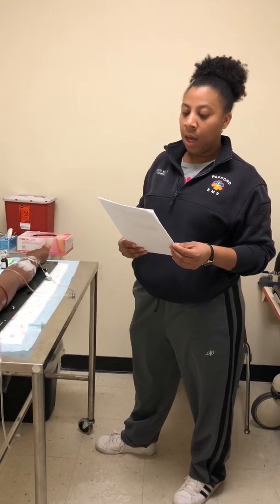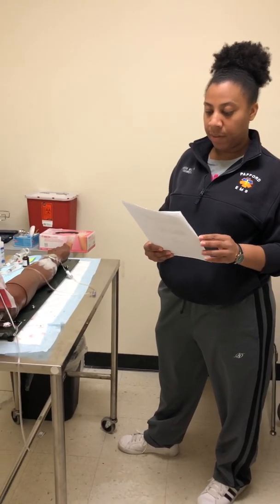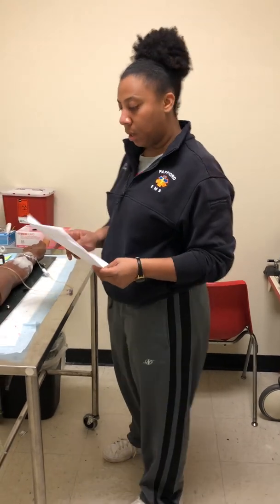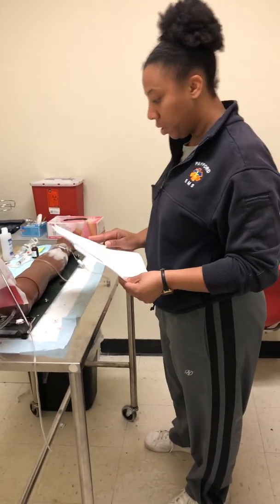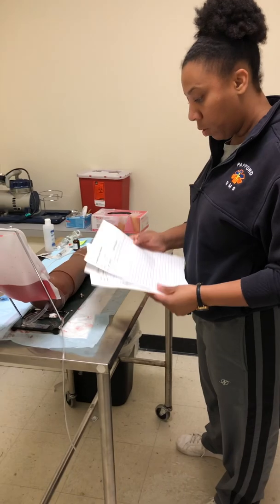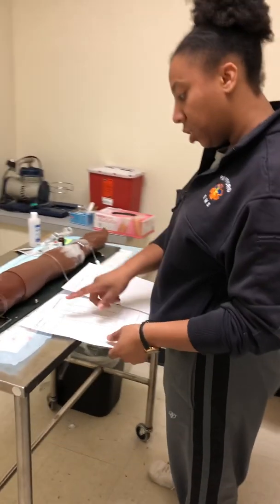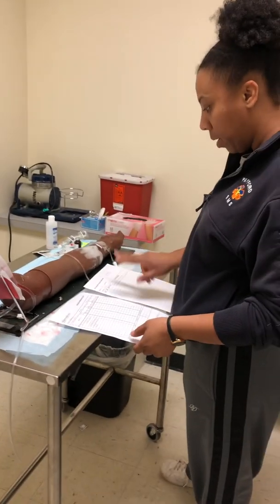Okay. I'm going to be doing an IV push on my patient. The first thing I need to do is to check my physician order and compare that to my MARA. I'm going to check to make sure it's the correct patient on both the physician order and the MARA. So my patient is Janet Green, and okay, that matches on both.